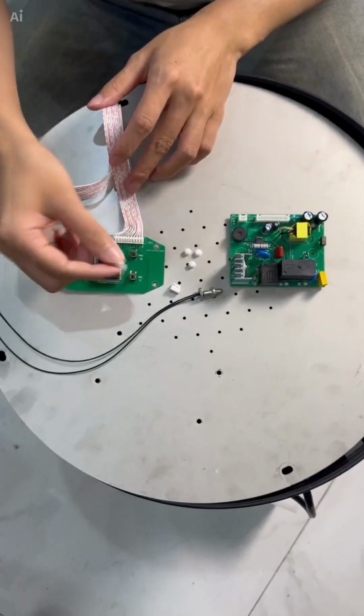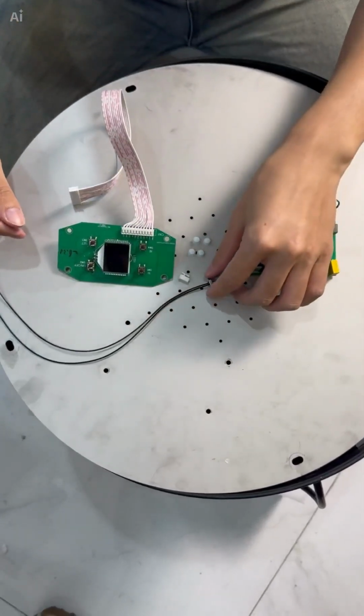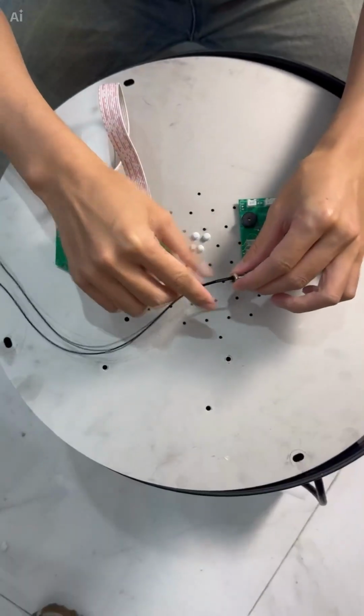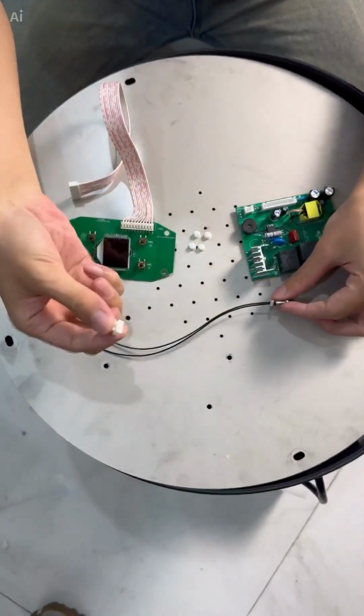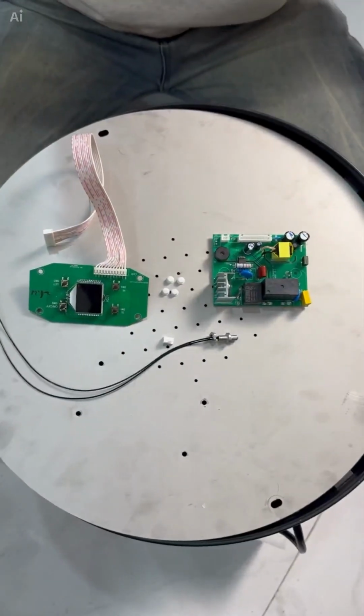Then there's the safety cap, which is installed here. There's also a temperature probe, which looks like this, and this is also its accessory, the temperature probe. In total, we are replacing these items.